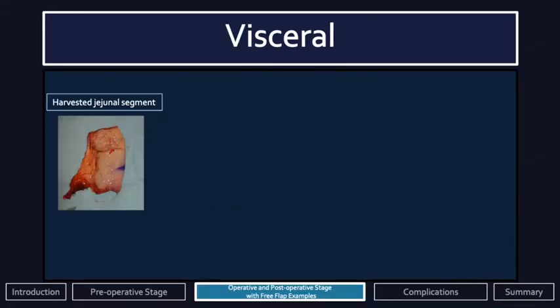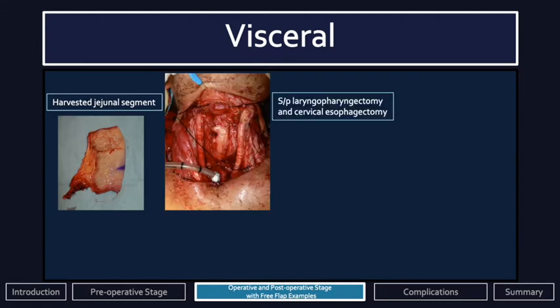Visceral flaps used in the head and neck include omentum and jejunum. As a mucus-producing tubular structure of similar size, the jejunum seems a natural replacement for the cervical esophagus. Upon transfer, the jejunum retains some of its contractility, and that can actually be beneficial for swallowing, provided the flap is inset correctly. This flap is fragile, doesn't tolerate long periods of ischemia, and there's some morbidity associated with small bowel resection. However, with this flap and a TEP, the patient can maintain speech.